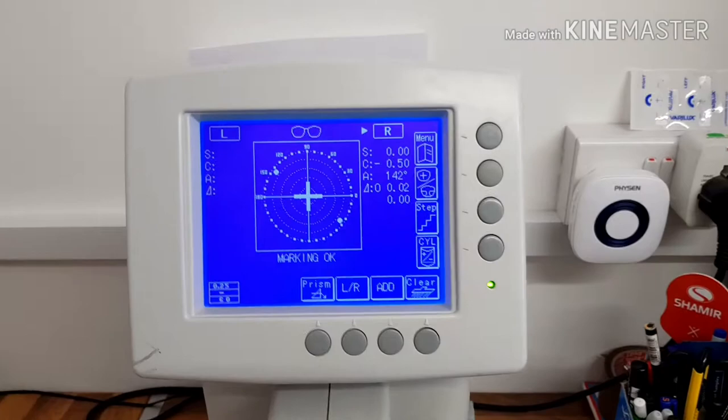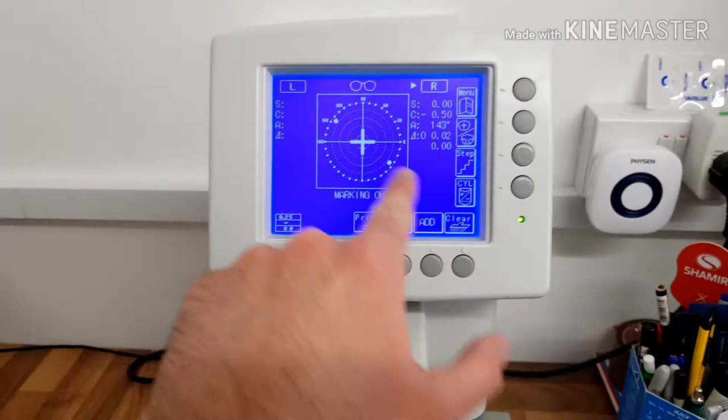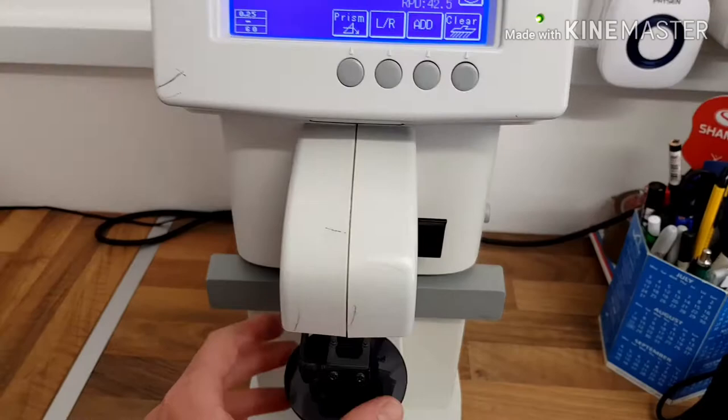So first thing we do is I'm checking the lens in this machine here, which is called a lens meter or a fascimeter. Basically checking to make sure the prescription for my customer is right and the lenses are accurate and are going to be perfect when we put them into the frame.